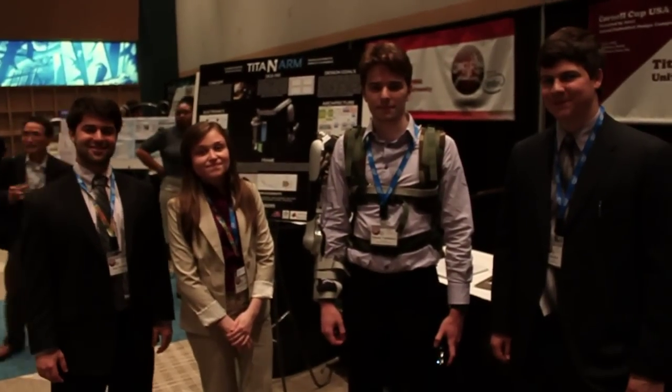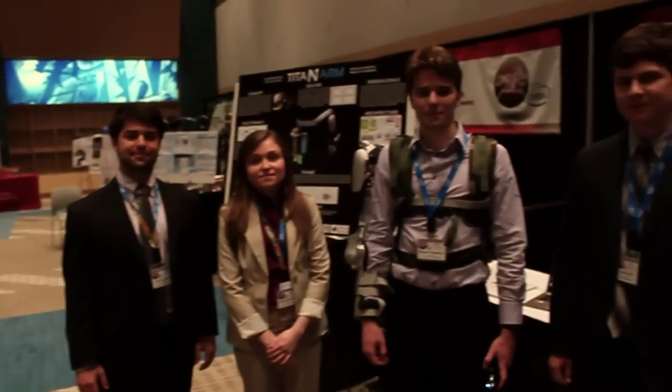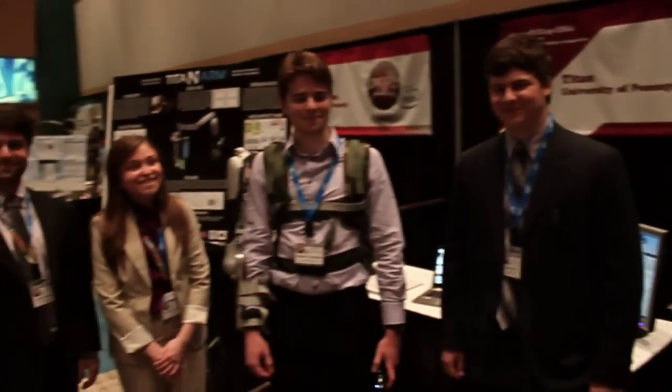Hey there, this is Alexey Santos with Engadget, and we're here with four University of Pennsylvania students who are working on the Titan Arm: Nick Parada, Elizabeth Beatty, Niko Vladimirov, and Nick McGill. So Niko, can you give us a tour of the Titan Arm?